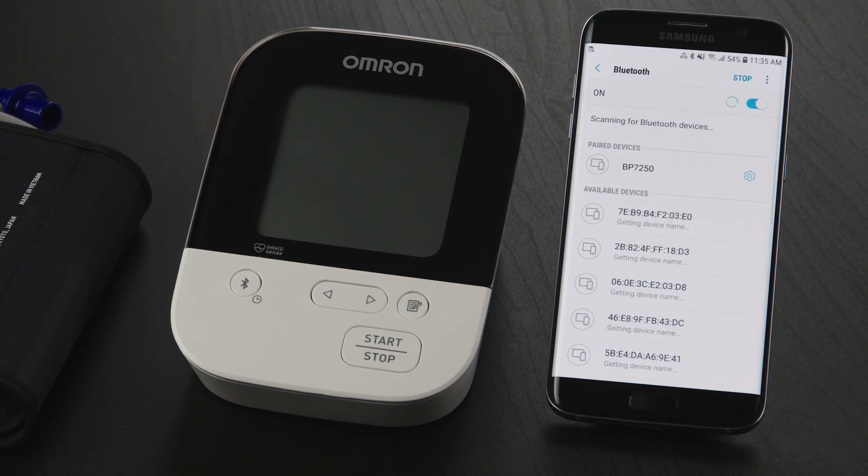Look for a device that starts with BP, HEM, BCM, or BLE Smart.